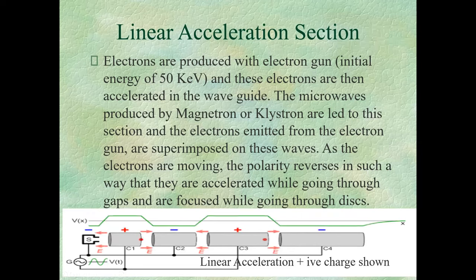When your ion chamber goes out and it is replaced, then you have to do all kinds of tests: flatness and symmetry of your beam, check PDDs, the energy of your X-rays and electrons, and then also the absolute output. Some people use TG-51, and I think the International Atomic Energy Agency has a protocol called TRS-398. It is either 397 or 398, I'm confusing here. But when you are using any one of them, expect a 15 to 20% difference in your output once the ion chamber is changed in the linear accelerator head.